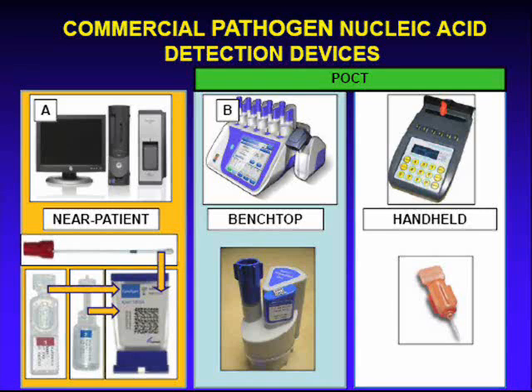It is for near patient use only at this time. It cannot be used for the point of care given that it has a computer or laptop connected to it. However, it must be noted and commended that it uses a cartridge-based approach, which reduces the potential for pre-analytical confounding variables such as contamination. However, there are movements towards the point of care. Cepheid, for example, will continue on and describes that they will consider point of care based testing.